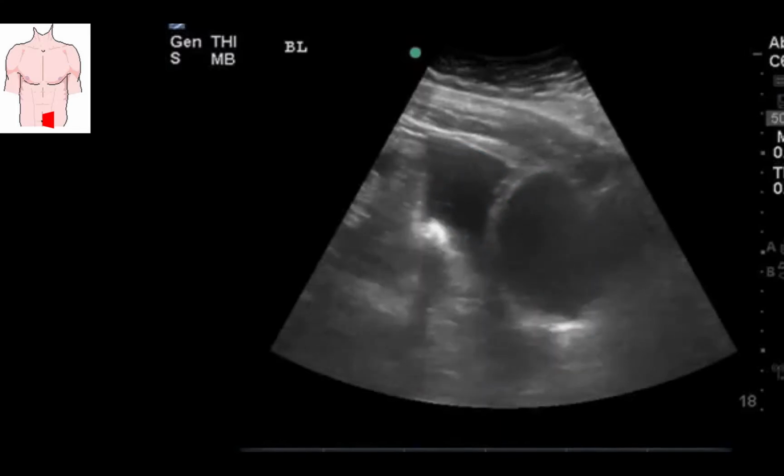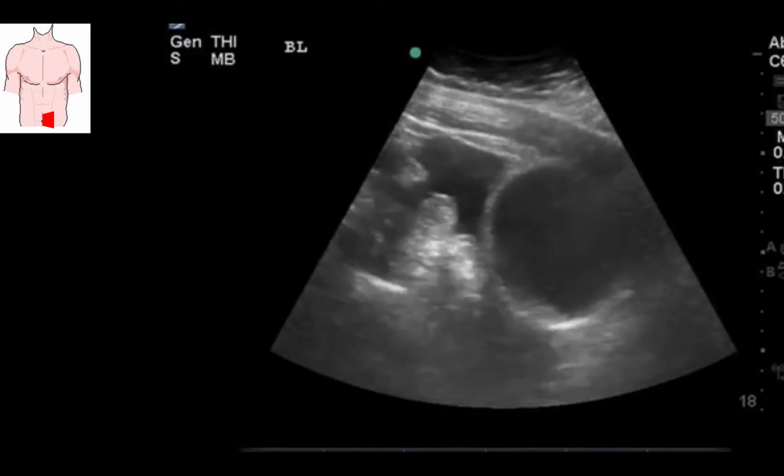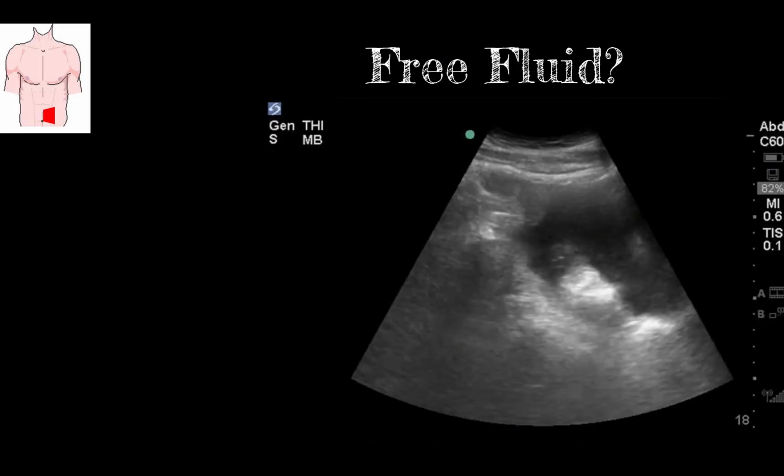It appears from case reports like these that the sagittal view is much more sensitive for free fluid, so if you have to choose one view, you should go sagittal during this exam. Here's another example. This view doesn't even capture the bladder. They didn't go low enough.